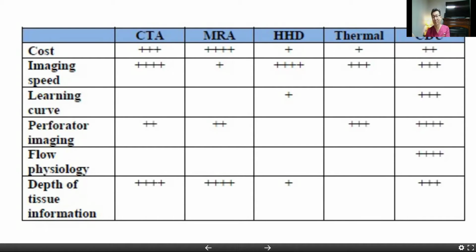to now using ultrasound, it's because it's just, in one word, much simpler, easier, and it gives you real-time information. So using the ultrasound, I think we're able to exactly know where the perforators are, and not only that, know the functionality or the physiologic aspect of the perforators, along with the anatomical structures beneath the skin.